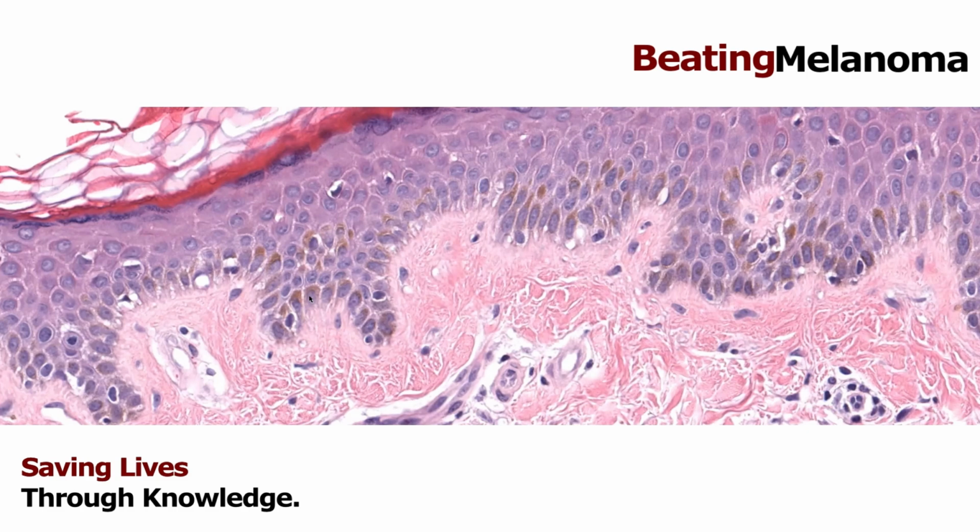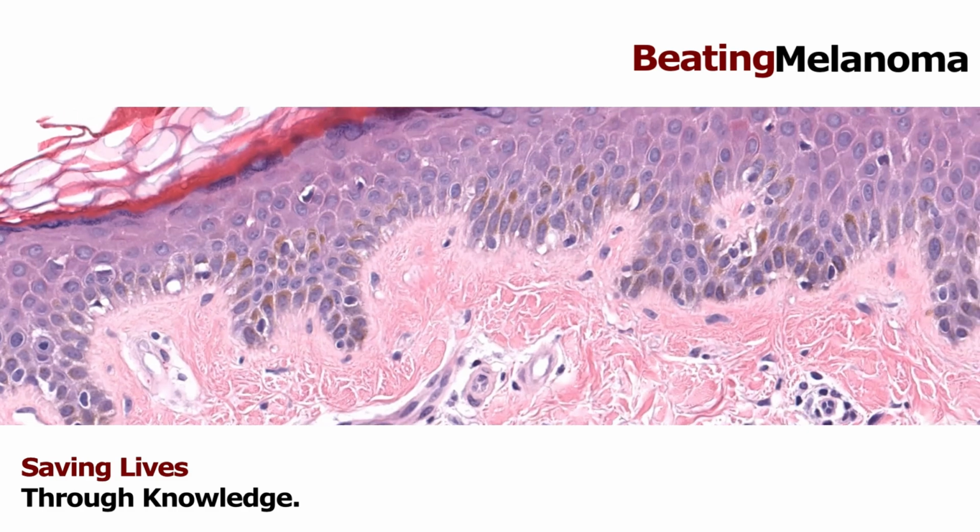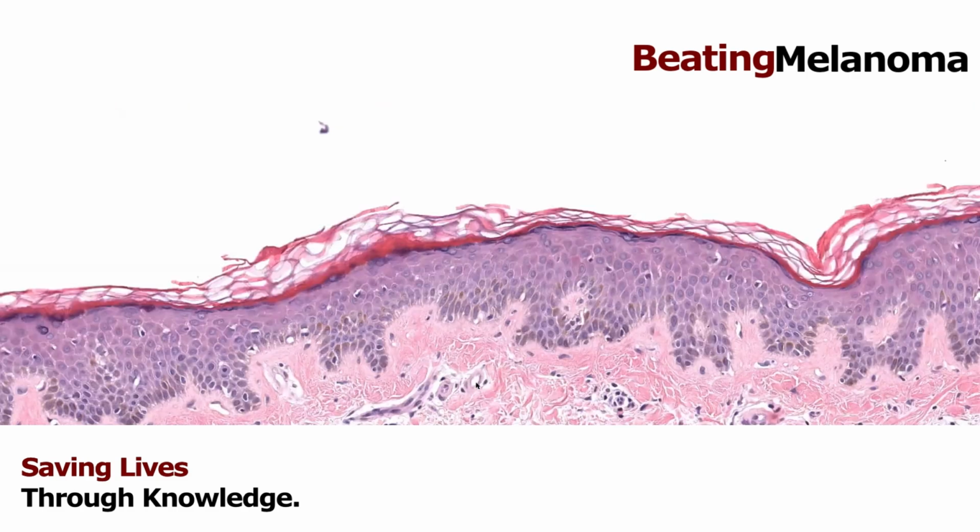So it's kind of cool, huh? Yeah, it is very cool. No nevus or melanoma here. This is just normal skin.